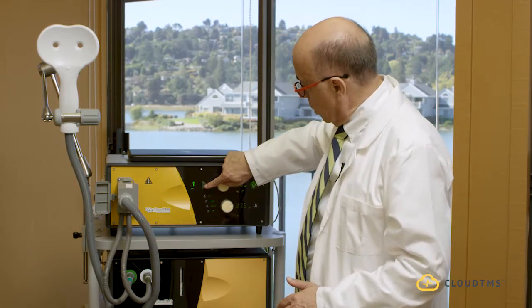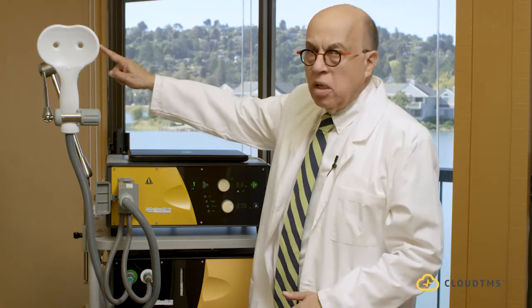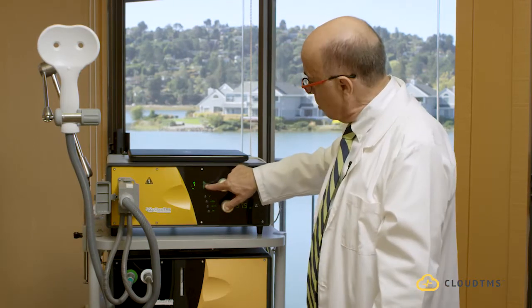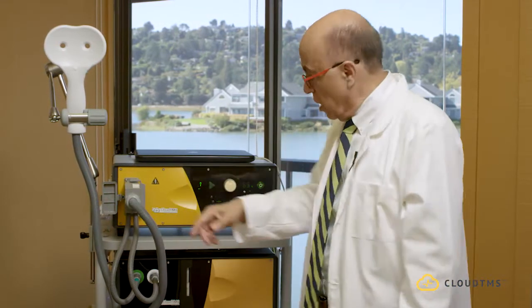I'm going to press this button, and you're going to hear a noise coming out of this coil, which means it's stimulating. Obviously, this coil would be against the patient's head, but right now I'm just showing you how to turn the machine on and set it up. As soon as I press this, you're going to hear 10 Hz for 4 seconds, then it's going to stop for 26 seconds, then start over again.